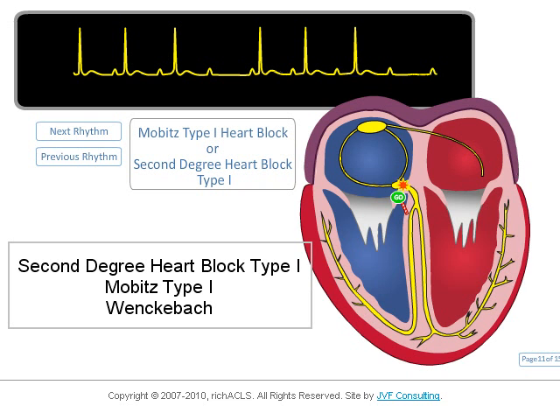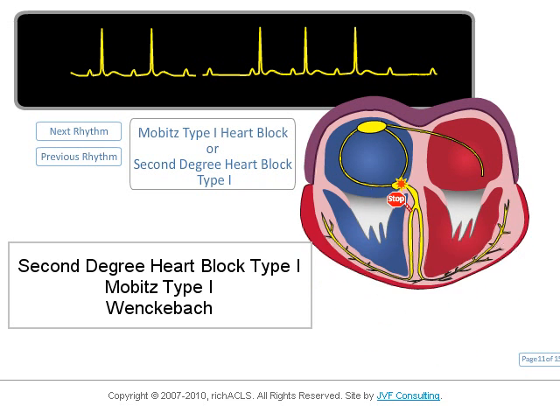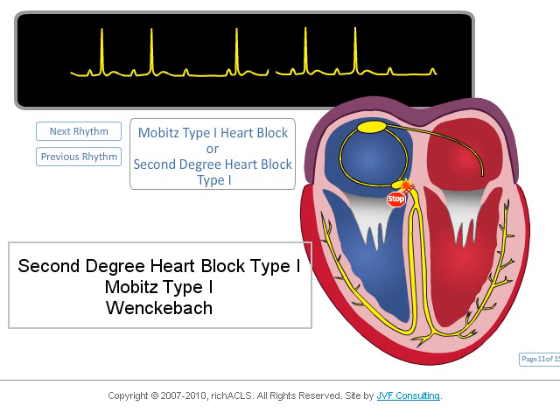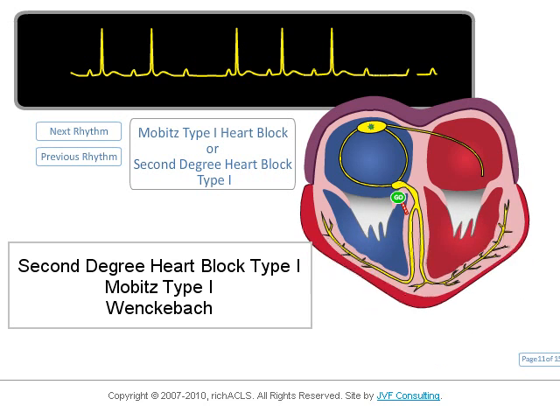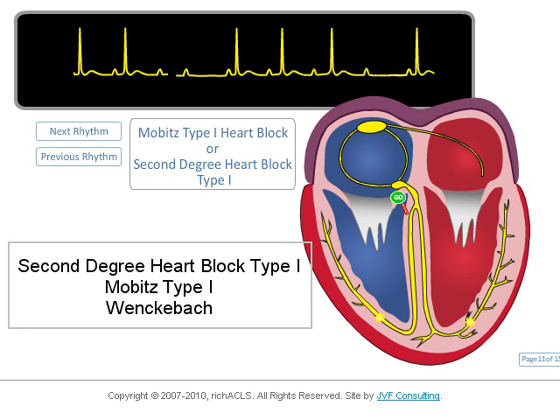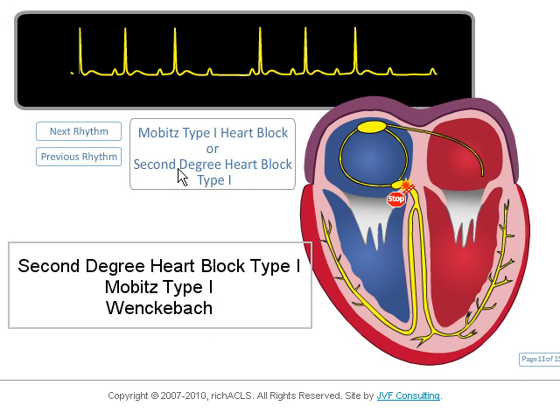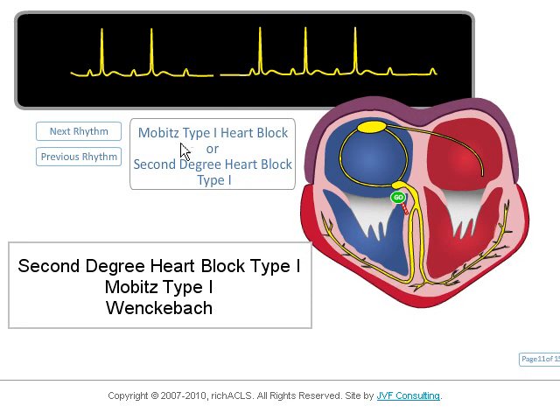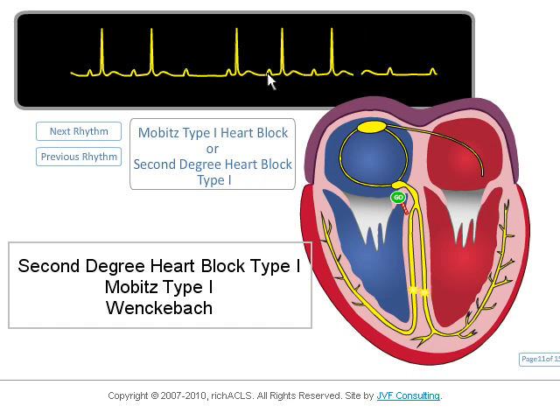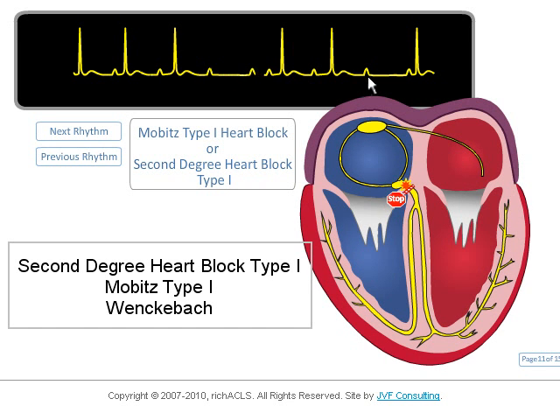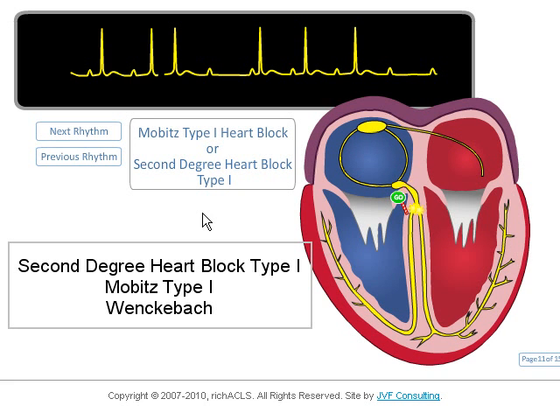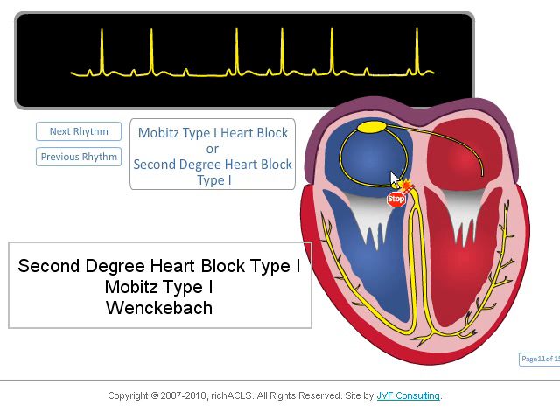Here is the second-degree heart block type I, also called Mobitz type I or Wenckebach. The unique characteristic of this normally benign block is a progressive lengthening of the PR interval until an atrial impulse is not conducted through the AV node. The problem is with the tissue in the AV node and is usually transient.